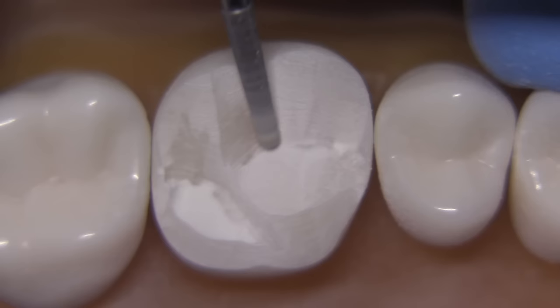Interproximal clearance is one of the more difficult steps of the preparation, particularly on the distal, and we're going to use the 859010. This is a needle-shaped burr and we're going to paint it through the interproximal step by step, starting at the base and working our way up rather than trying to push the entire burr through the interproximal space. We paint the burr through gradually, holding the handpiece very stable — focused on not going too deep axially, not over-tapering, and not hitting the adjacent tooth. The purpose of this step is merely to break contact; don't concern yourself at all with the shape of the chamfer.